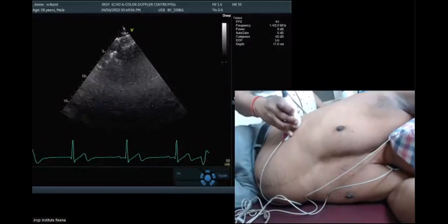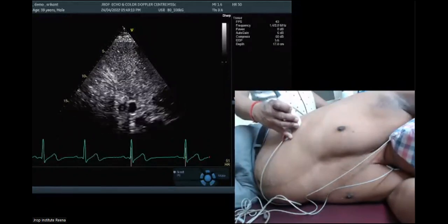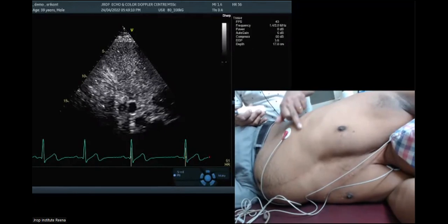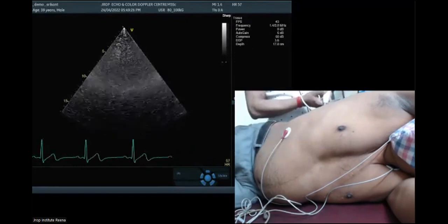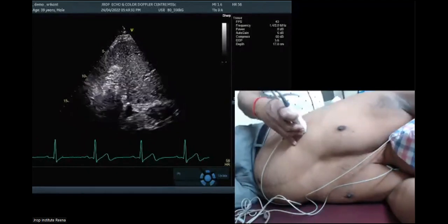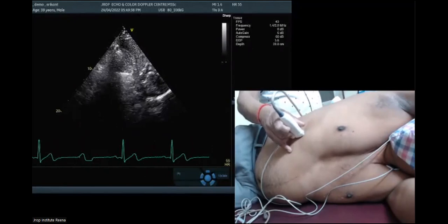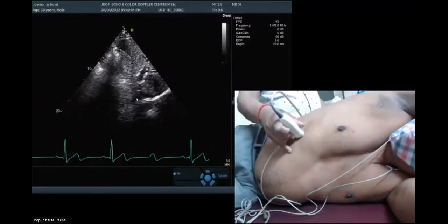I can't demonstrate over here because of not a good technical window. And that's what I wanted to show you. With this window also, you can look at your IVC. Because where the IVC is, if the heart is over here, the IVC will drain from this point to this point. So let me try it once again. Many times we do get it, many times we just have a problem getting it. But this is one which you can utilize in day-to-day practice for looking at IVC, representing volume status. Now you can see, beautiful. So this is the IVC.